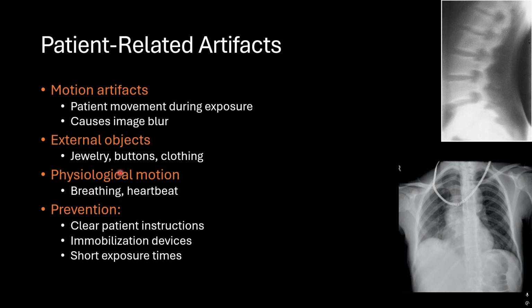So to prevent such artifacts, clear patient instructions should be given, so the procedure should be explained fully to the patient. Immobilization devices, such as for pediatrics, and short exposure times, for example, in chest x-ray.